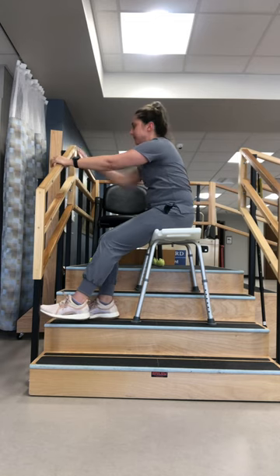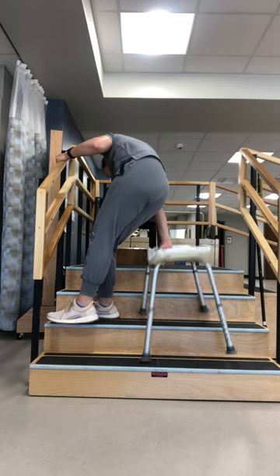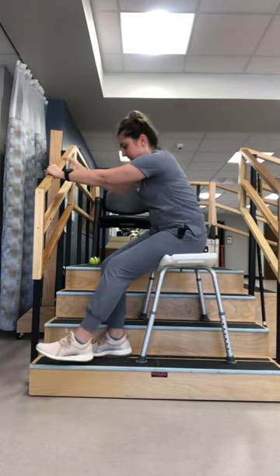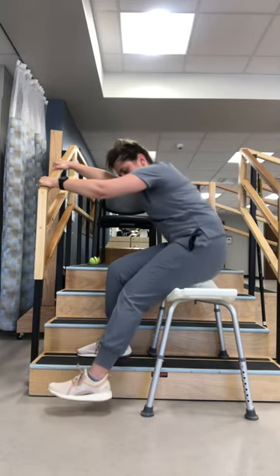Good leg down one step, pull yourself up with both hands, advance your shower chair, and slowly lower down. And now you're at the bottom of your steps.